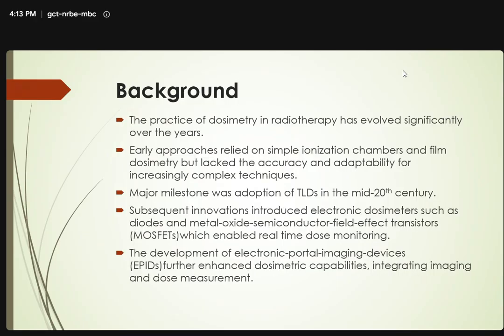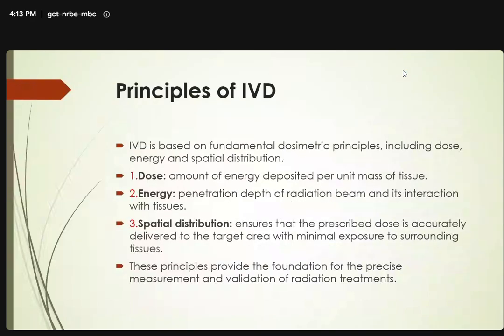The development of electronic portal imaging devices, EPIDs, further enhanced dosimetric capabilities, integrating imaging and dose measurements.